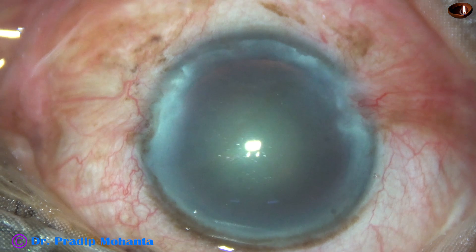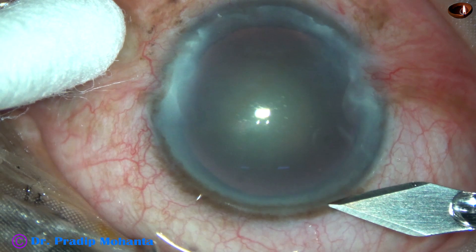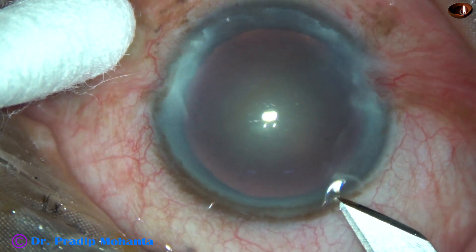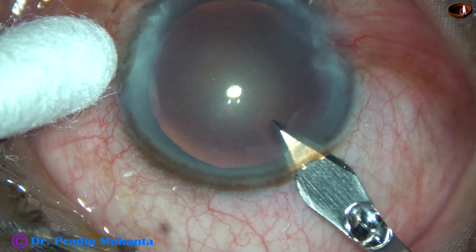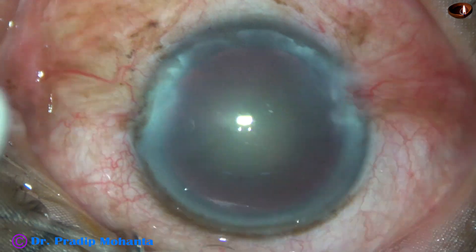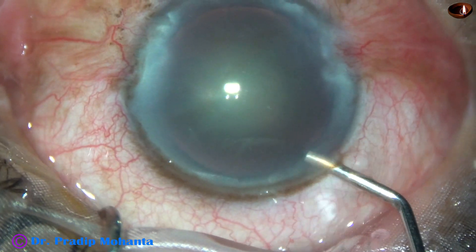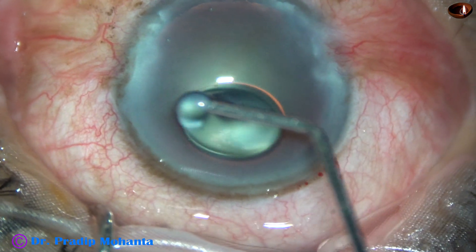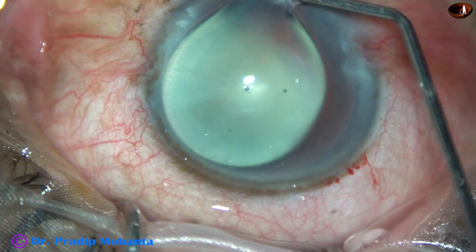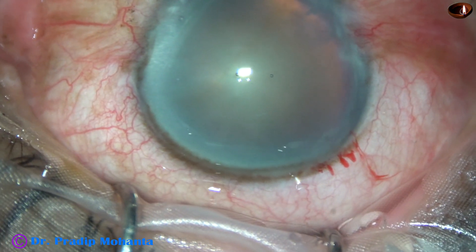So three times, three drops — nine drops of proparacaine is enough for topical FACO. In my surgery, I don't apply any more proparacaine and I don't use any intracameral lignocaine. Let us see with this anesthesia if we can do this surgery.